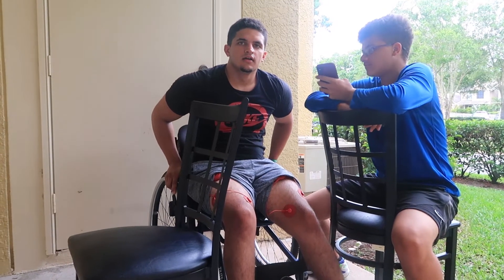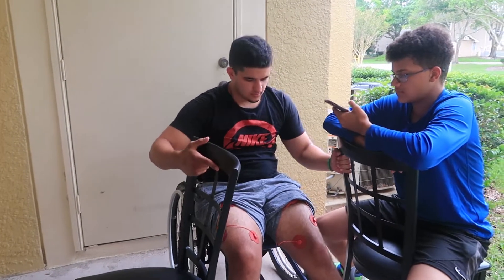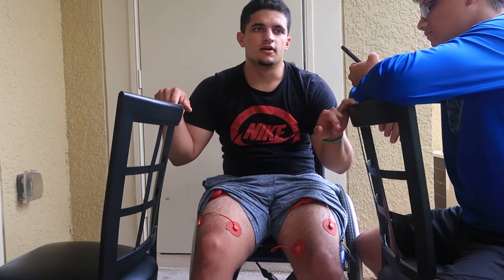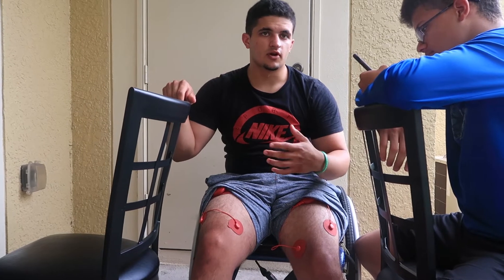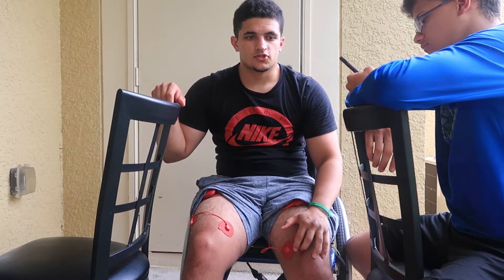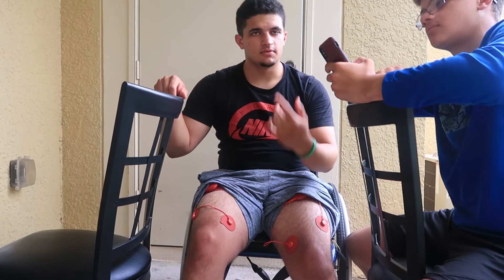So what's the difference from last time? It was easier to stand — last time you struggled a lot. Yeah, so far it's just easier to get up and maintain that position, because before I was having to rely so much on my arms and my legs were just floppy. This keeps them tight throughout the whole time, which allows me to stand for longer and more efficiently, using more of the muscles. I'm going to go through the next 17 minutes like that, and then that'll be the workout for right now.